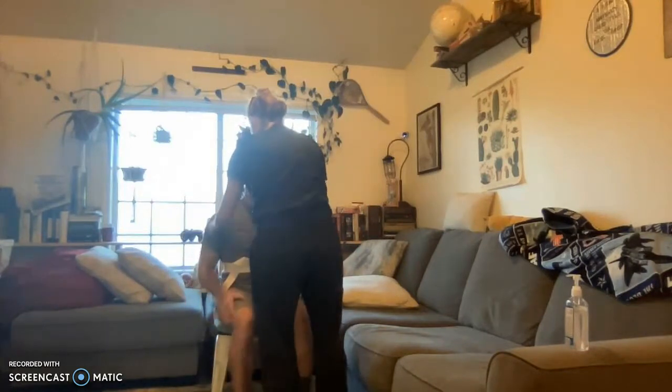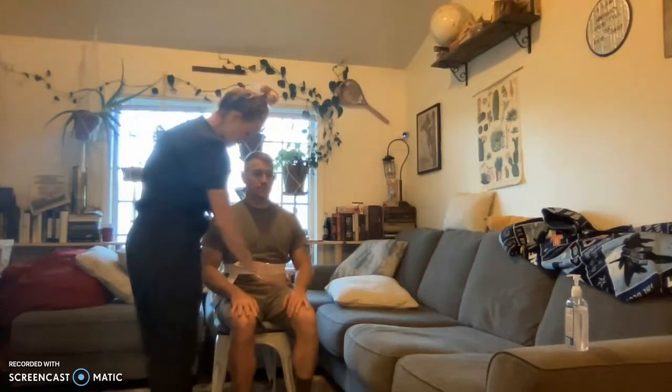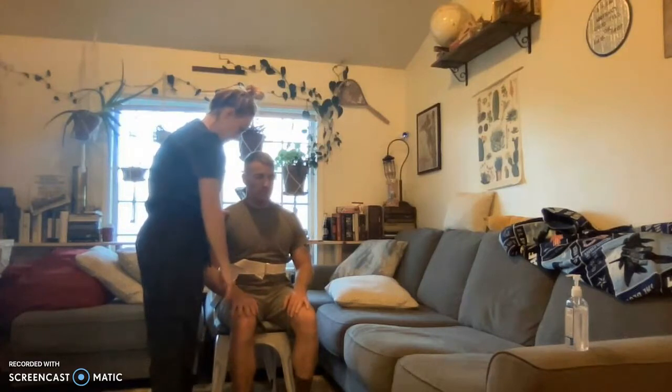All right, you can rock. Are you experiencing any lightheadedness or dizziness? No. Okay. I see you already have non-skid shoes on, so we don't need to apply those. We're going to need non-skid socks.